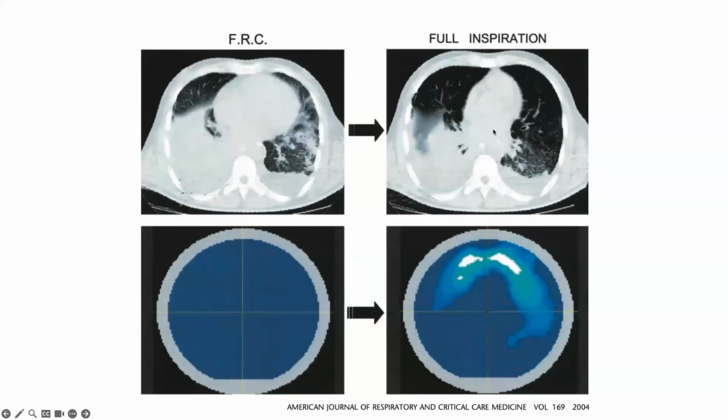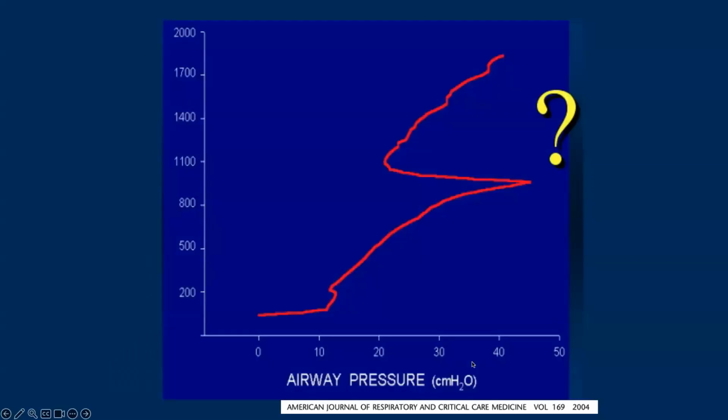Here, another case, we have some pleural effusion and atelectasis in the dorsal part of the lung from the beginning of inspiration till the end of inspiration. And clearly, the atelectatic zones and the pleural effusion remain silent. And EIT, again, in this image, suggests only anterior change in the ventilation distribution, not in the dorsal part.